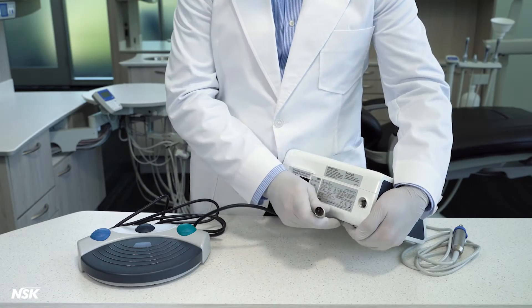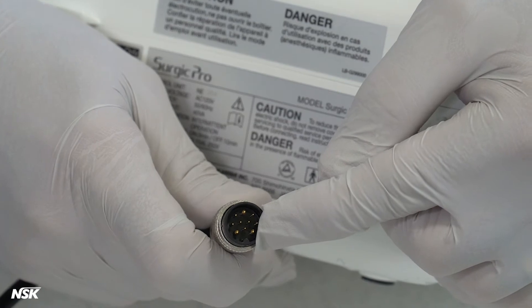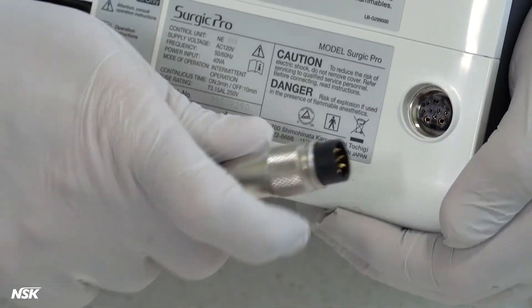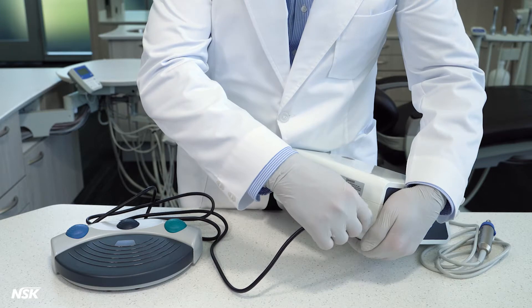Next, connect the foot control cord using the guide pin located at the bottom of the connector, which is at the back of the unit. Tighten the lock nut to screw and secure the connection.